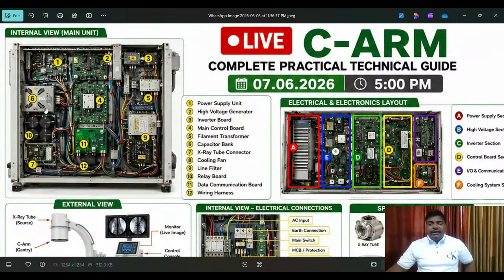Actually, opening the parts is not possible in regular time. You cannot see all these parts in your work area because there are many engineers. Many junior engineers say, sir I am a junior, sir I don't know, and escape. Then you can never learn anything. If you have a strong aim and a strong ambition, then you should follow everything I'm saying. Please listen carefully and focus on this.